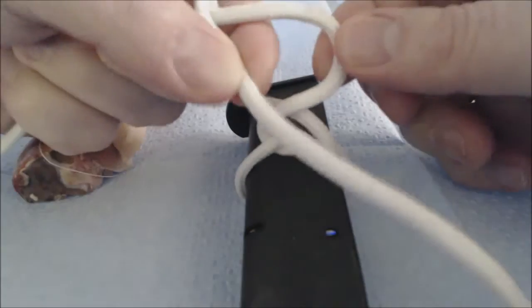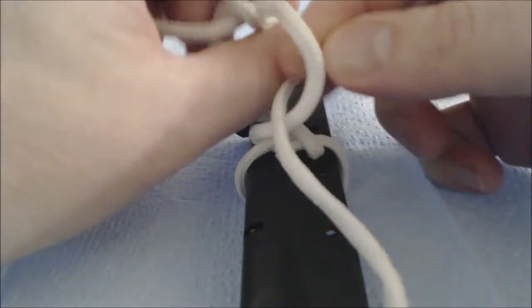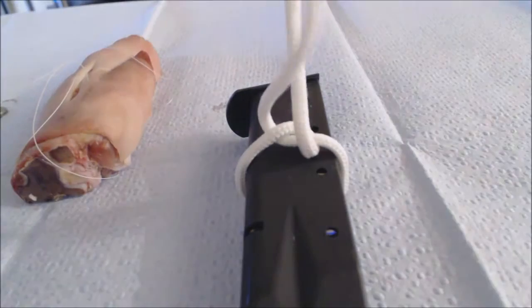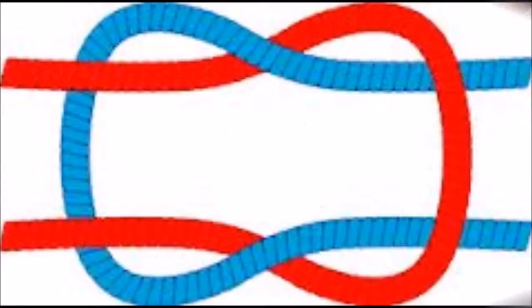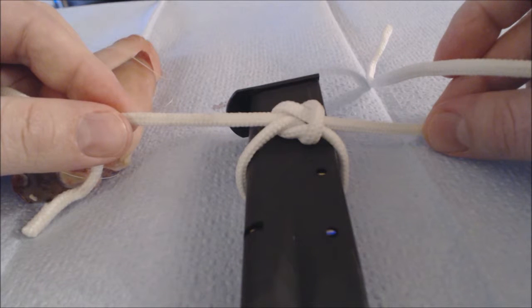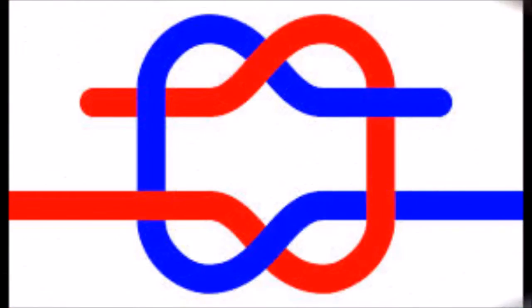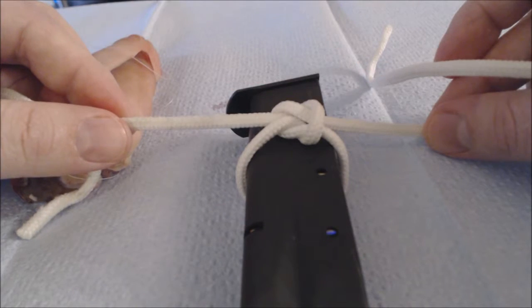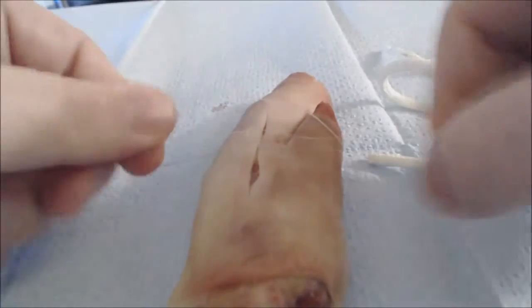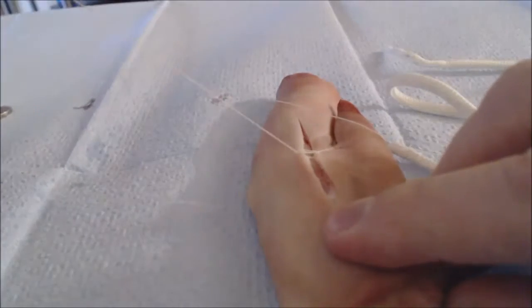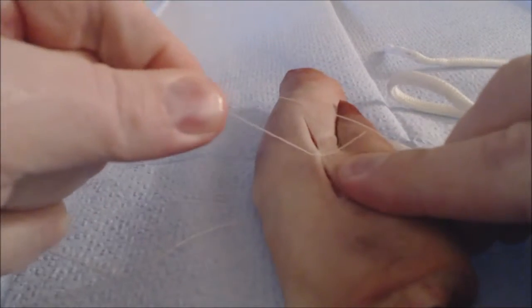Grab a pincer movement and then push the string through this circle in the opposite direction. Grabbing it, we'll see that when we tie it down, it'll lay down into a nice square knot. If you don't do a square knot, if you end up with a granny knot or slipknot, then the suture may fail by slipping apart from itself when tension is placed. For instance, if we were to have made a slipknot accidentally in this pig's foot, after we tie it, what will happen is the knot will slip. It didn't in this particular case, but it should slip out accidentally, as you see here.